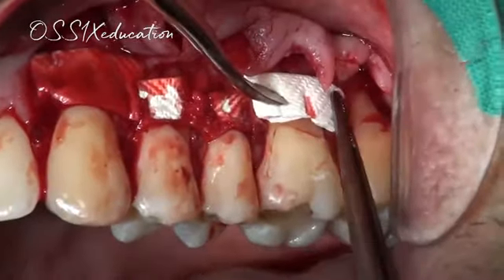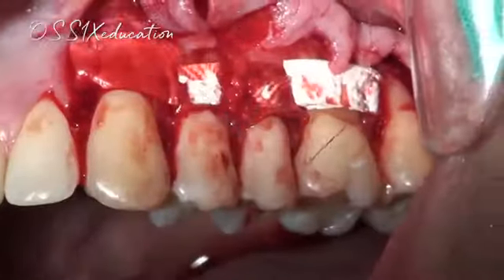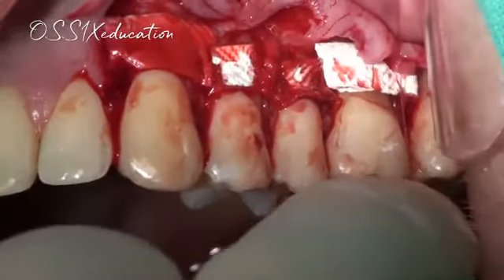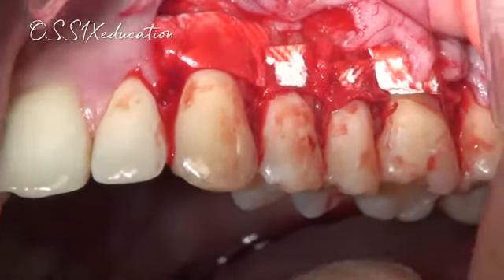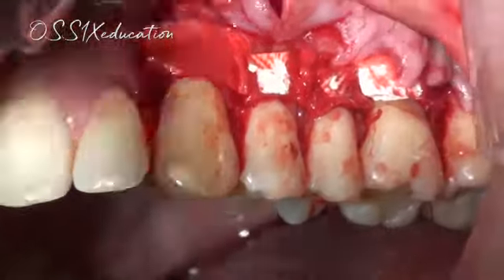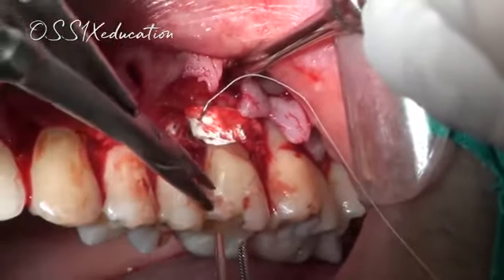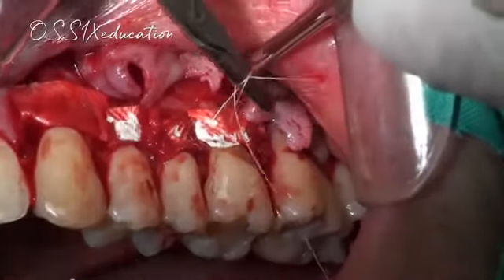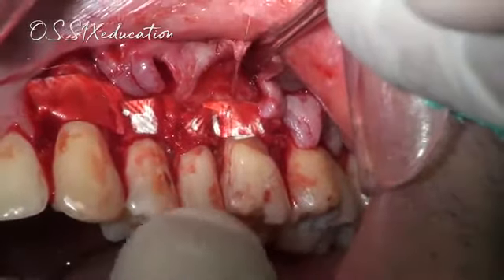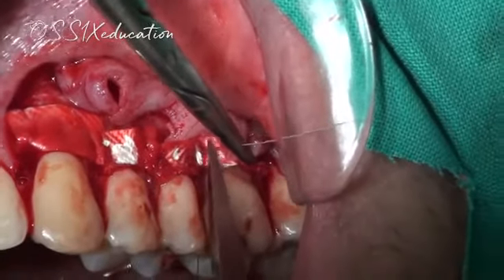Although, as I told you initially, the success rate in the molar area for me is not so spectacular, still these recessions are so large in the molar area that this really necessitates that we place the graft. And I think I'll probably get around 50% of recession coverage, but we will follow this case in the long term. So I promise you will get all the photos and the follow-up. The initial healing, the 2 week healing, and then we will follow it at 1 month, 2 months. So we'll follow this case really precisely, because in the end, that's what you're interested in, how the material behaves in the long term.